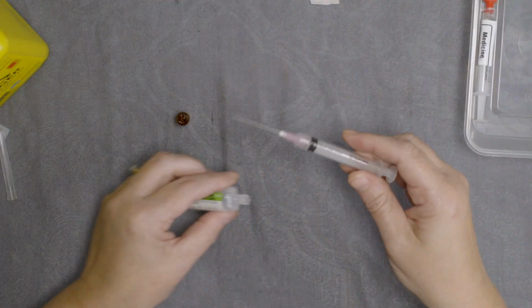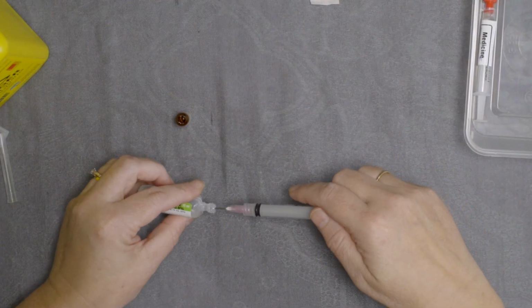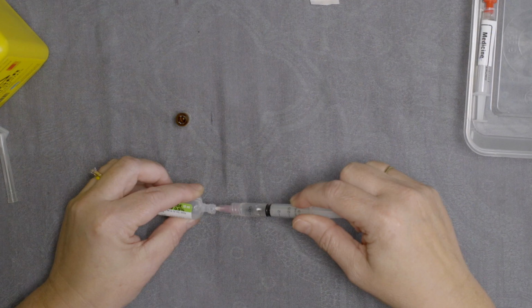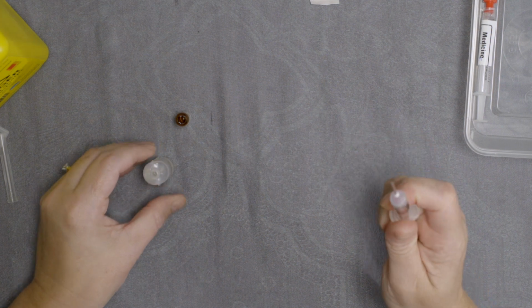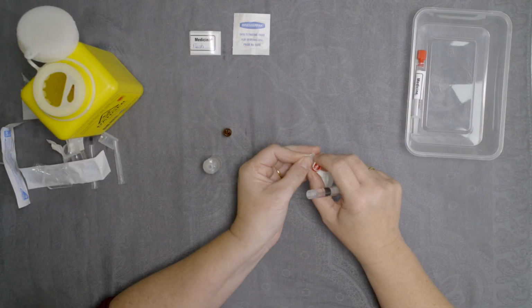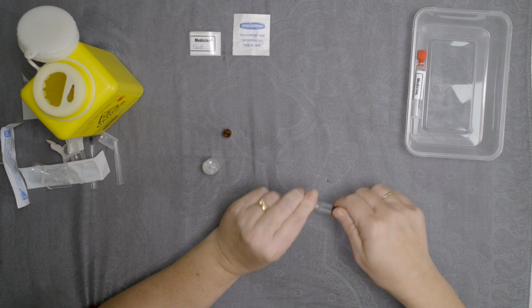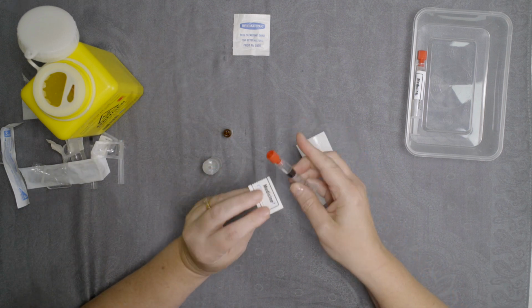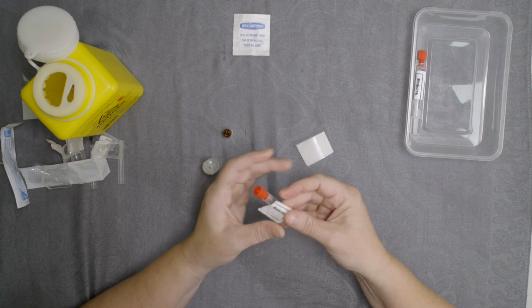With a new needle and syringe, place the needle into the ampule and draw up 1 ml. Remove the needle and replace it with a red cap. It is important not to confuse the two syringes, so label the flush syringe straight away.